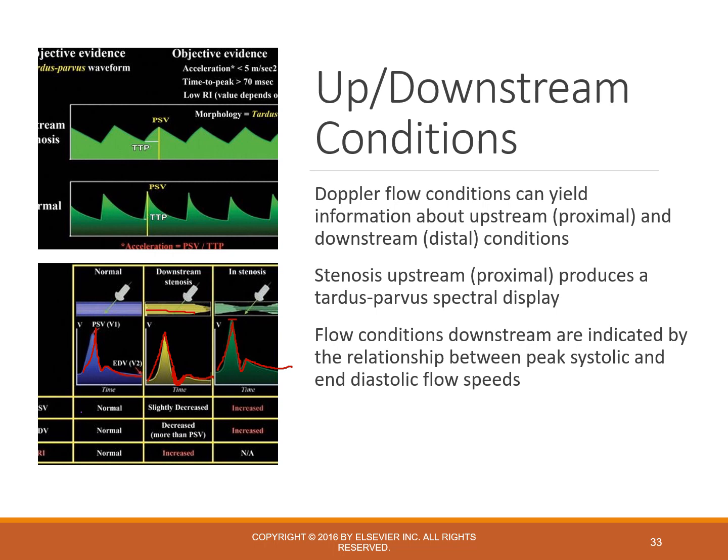Now, most of the time you might think that doesn't even matter. Why would I care what's ahead if I'm going to see it anyway? But sometimes you'll get to parts of the body where you're just not able to see a certain area of a vessel, maybe because it's under bone or something else. And so these indicators can be lifesavers in finding these issues when you can't see in a particular area.